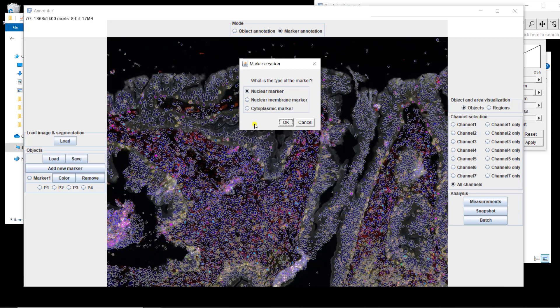These are different kinds of markers. For example, DAPI is nuclear — it stains the DNA, which is in the nucleus. Cytokeratin, used for epithelium, is cytoplasmic — there's very low signal inside the nucleus but higher signal outside when the cell is epithelial. CD4 and CD8 are nuclear membrane markers — they're expressed on the membrane. For all identification methods, the algorithm looks inside the nucleus for nuclear markers, a bit inside and outside for nuclear membrane markers, and outside for cytoplasmic markers.